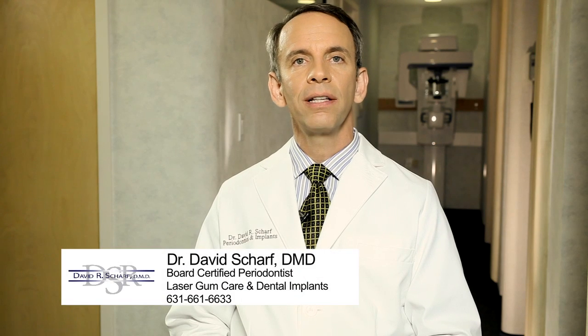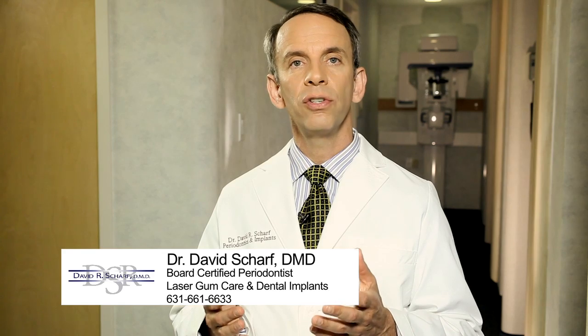One exciting piece of technology we have in the office is called Previsor Dental Software. And Previsor is risk analysis software. Basically what we do is after we examine a patient, we put that clinical data into the software program, and then we take measurements from the patient's x-rays and we put that information into the software program as well.